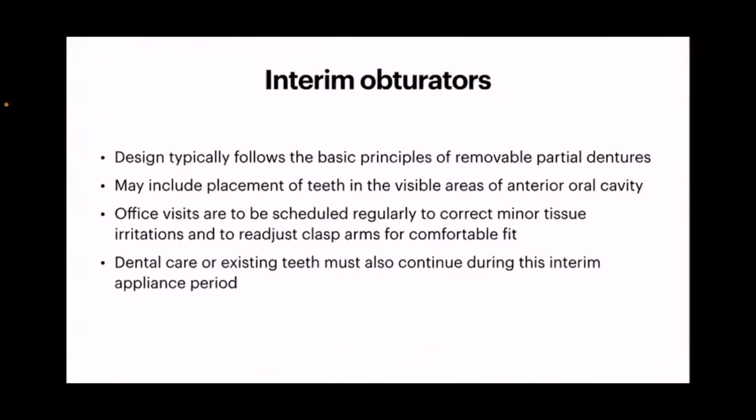Interim obturators. The design typically follows the basic principles of the removable partial dentures. It may include the placement of teeth in the visible area. We can replace a few of the anterior teeth, which aids the patient with better aesthetics.